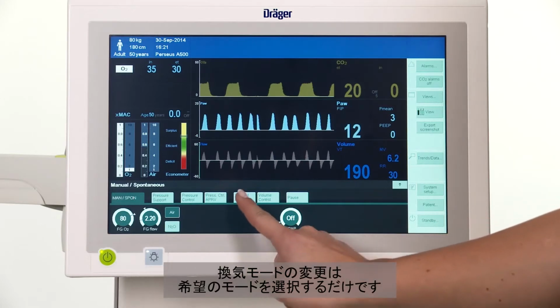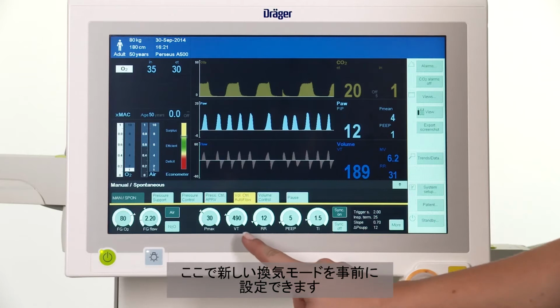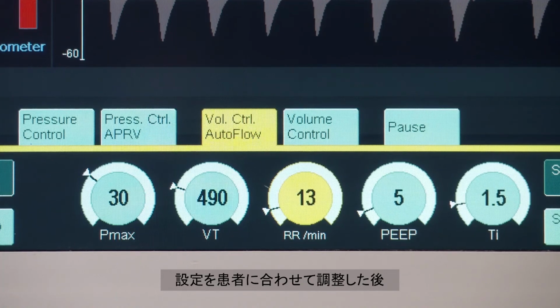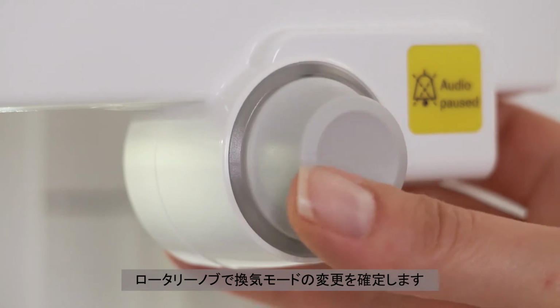To change the ventilation mode, simply select the desired mode. You will now have the option to preset the configuration of the new ventilation mode. After you've adjusted the settings to the respective patient, use the rotary knob to confirm the ventilation mode change.